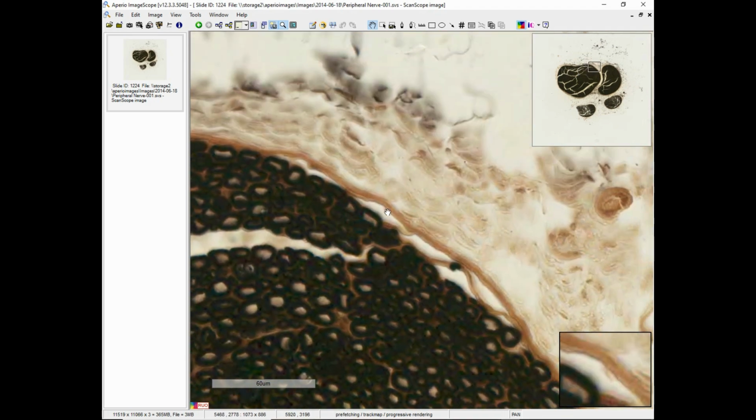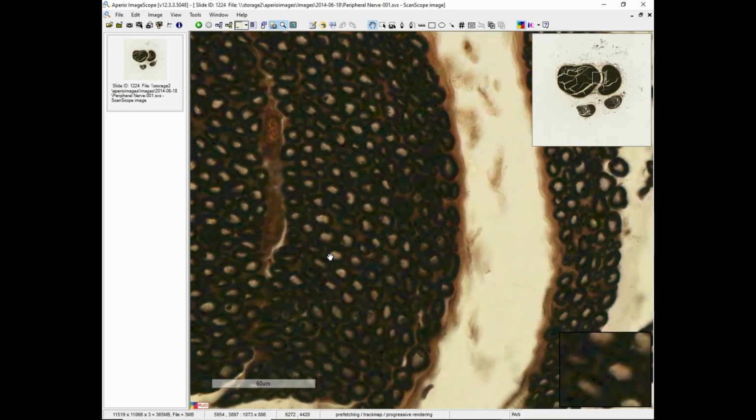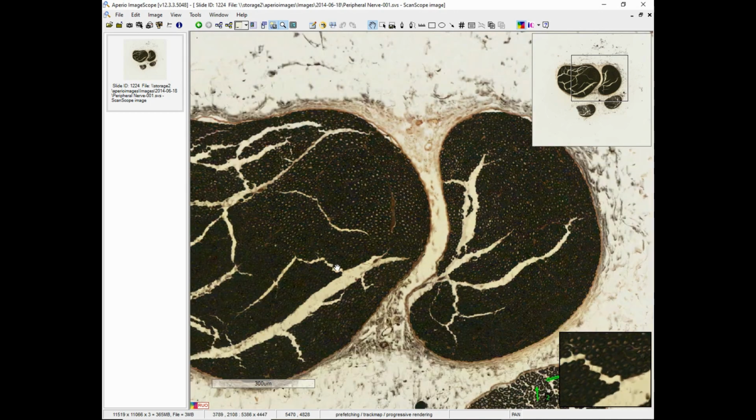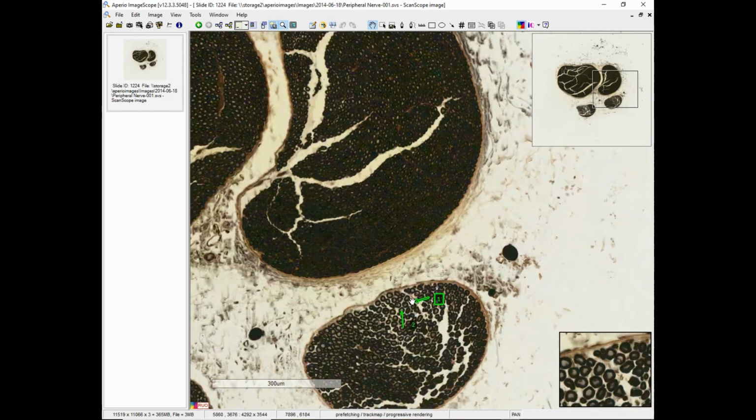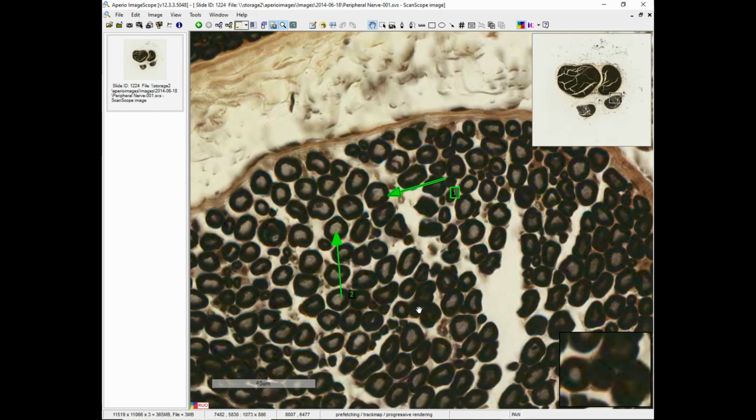So we can see connective tissue here, but this stain is not one we'd use to see the details of the connective tissue, but the myelin is showing up nice and clear. So let's see if we can do a quick little quiz, and you can tell me what you see here, arrow number 1 and arrow number 2. All right, well, of the things that we've been looking at today, arrow number 1 is pointing at the myelin sheath, and 2 is pointing to that inner area which would contain the axon.